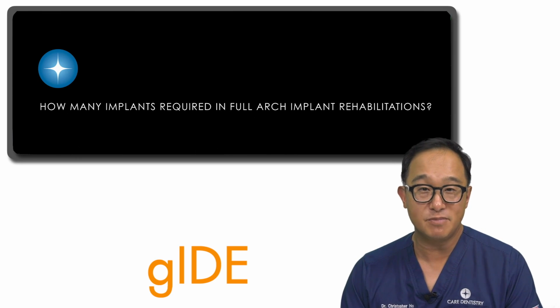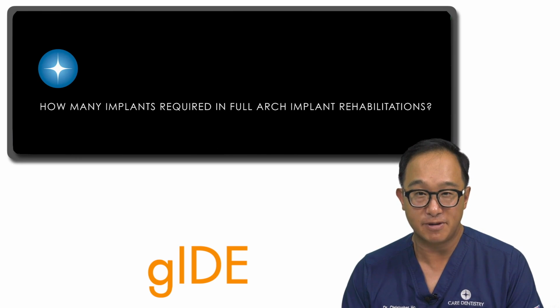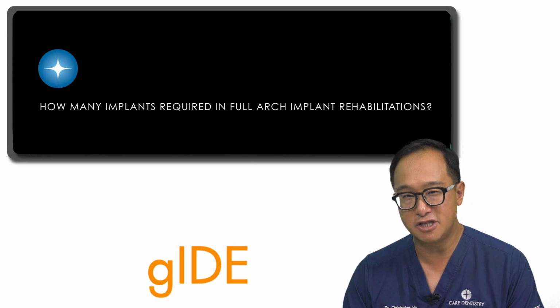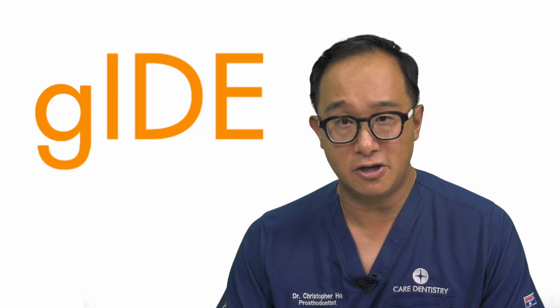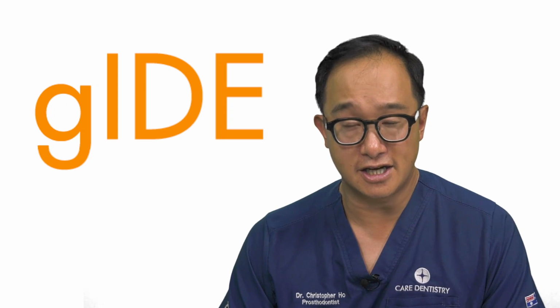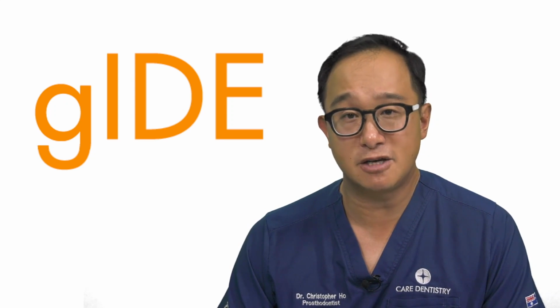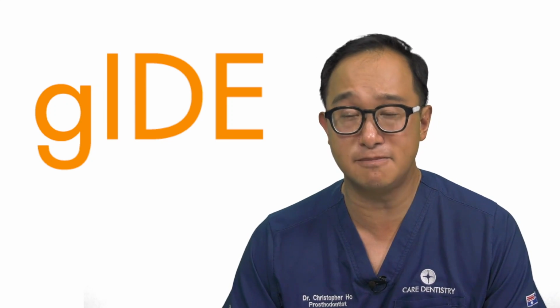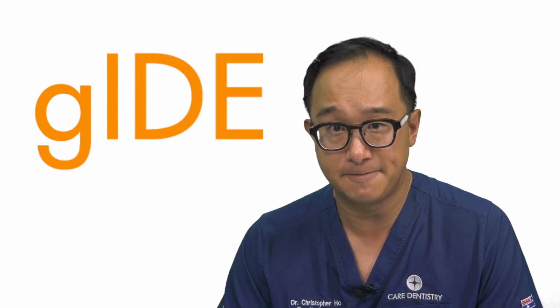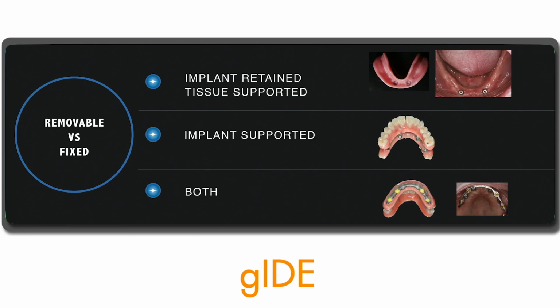So let's look at the number of implants required in a full arch implant rehabilitation. I often get asked, is 4 implants enough? When do I use 5? When do I use 6 implants? When do I use even more implants? Although all-on-4 is an approach that I like a lot, there are some patients that may not be suitable for an all-on type restoration. So we'll talk about some of the times that you may have to increase the number of implants. Firstly, I want you to look at whether you're going to use a removable solution or a fixed solution. I want you to become familiar with different terms.